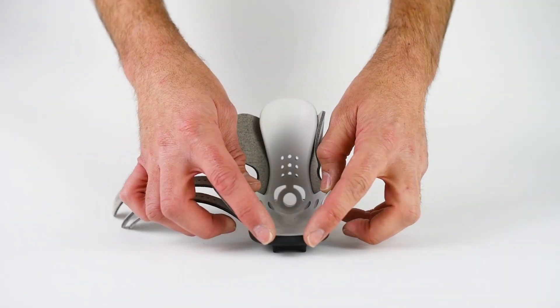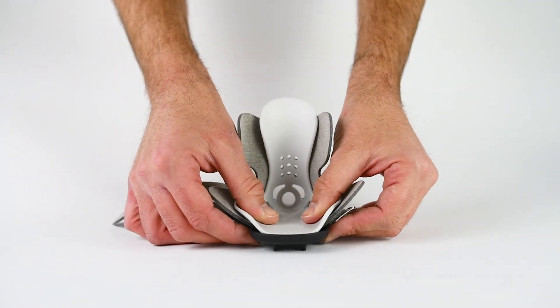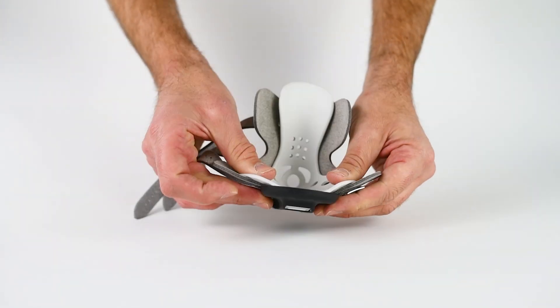You can also see from the front how we've made the sole plate wider to accommodate wider feet. If you do get a wide foot, it will overlap on the sides, and the buckles and straps will not get in the way to create pressure.